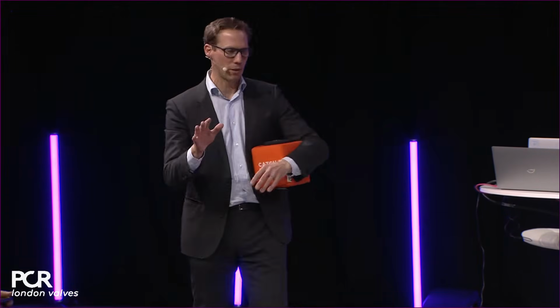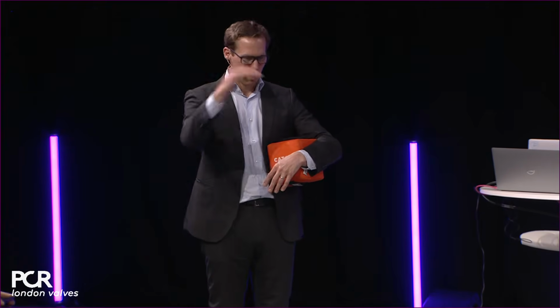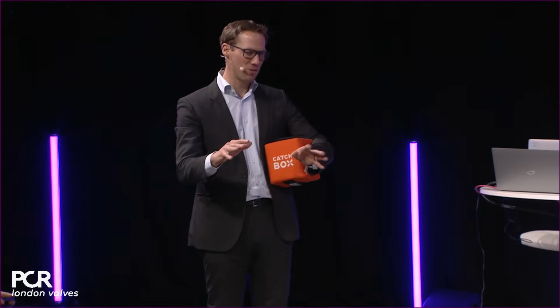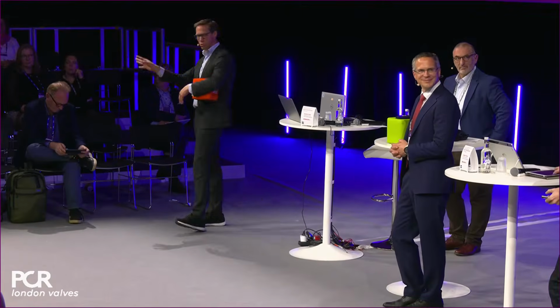Yeah. So good result, no PVL, and perfect commissural alignment in this patient, right? Honestly, the big difference with FX so far in my limited experience is that commissural alignment is perfect, and that's huge for younger patients. So I hope for the colleague there that it's clear now how the commissures work. If not, come down to us afterwards. We'll go through it with you. And if anyone else is unsure, we can do it afterwards.